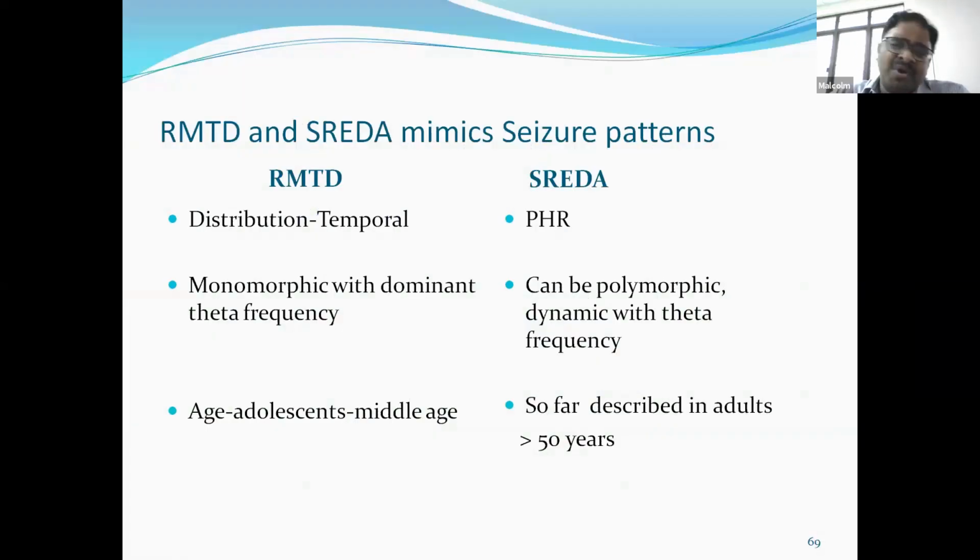Now, the point of differentiation would be between SREDA and RMTD rather than between SREDA and an epileptiform discharge. SREDA is more posterior, can be polymorphic and dynamic with a theta frequency, and it is so far described in adults more than 50 years.